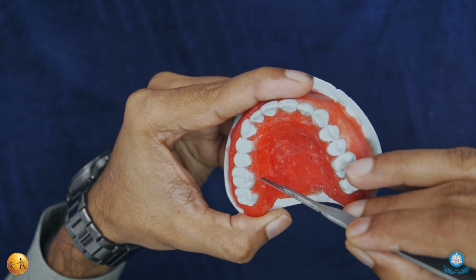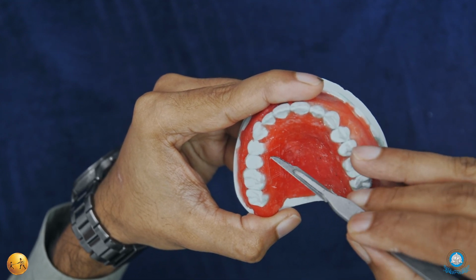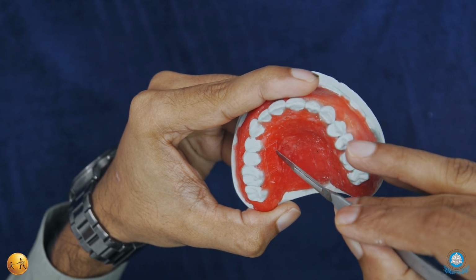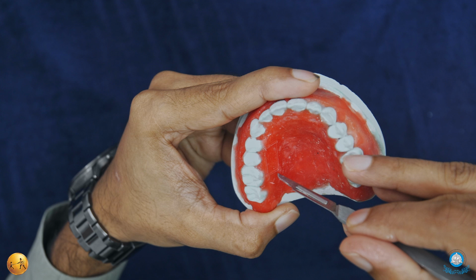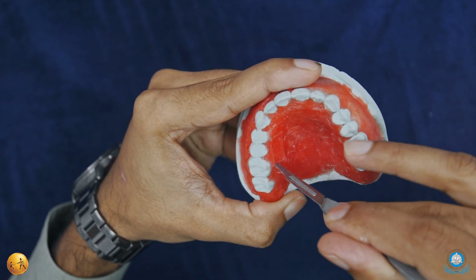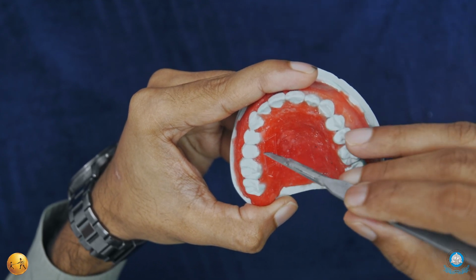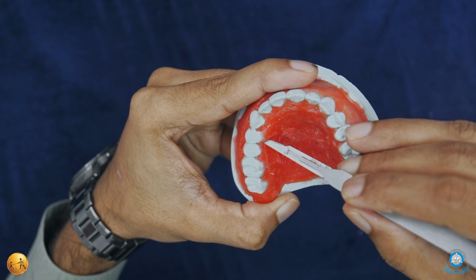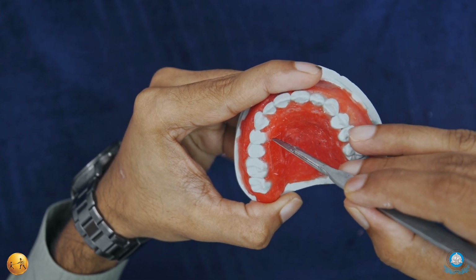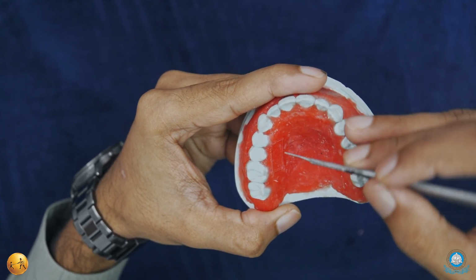Once we achieve this, we can start harvesting the graft. Remember, the ideal thickness that is required for a free gingival graft is 1 to 1.5 millimeters. Anything which is thinner than that will necrose. Anything thicker than that will not allow nutrition or blood vessels to survive, to make the graft survive. So 1 to 1.5 mm is the thickness.